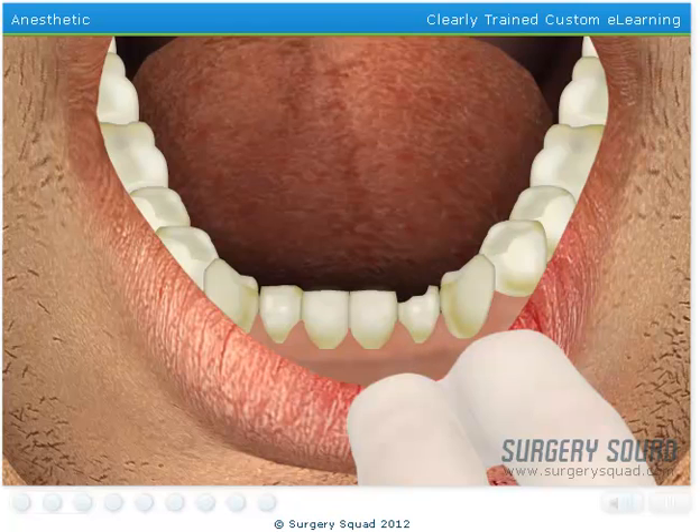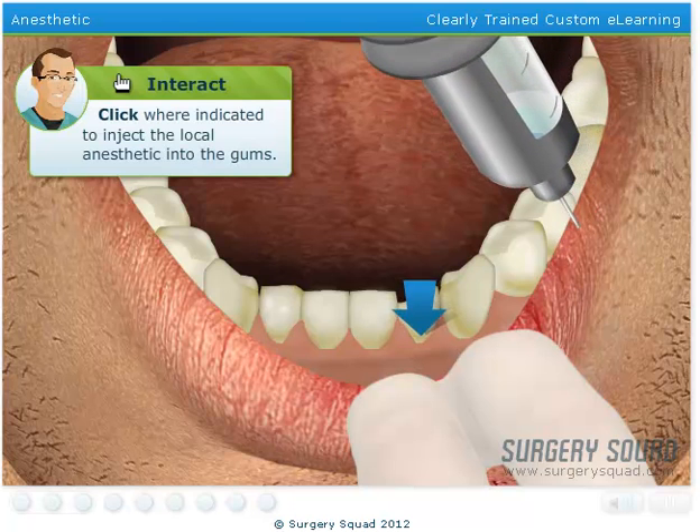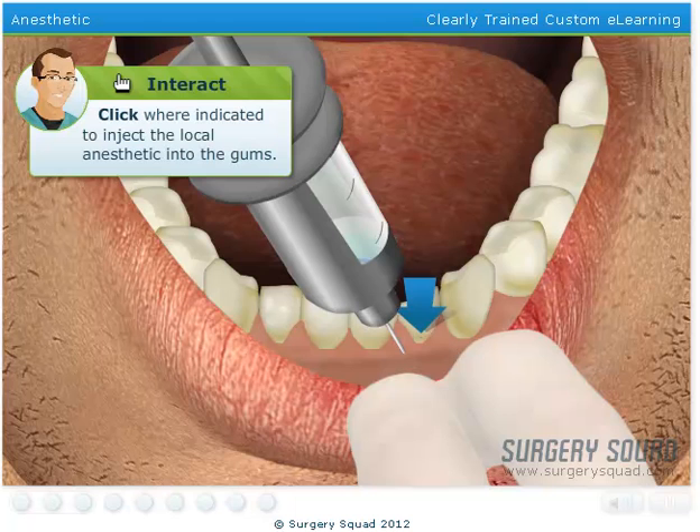Now we need to inject the local anesthetic. After it has taken effect, the area around the tooth and the patient's lower lip should be numb for a few hours. Inject the local anesthetic into the patient's gums, just below the tooth we'll be working on.